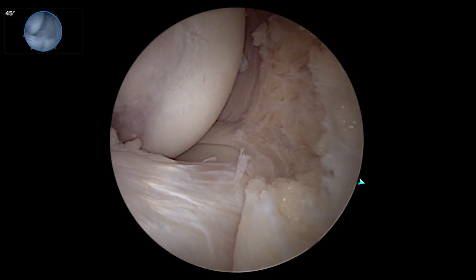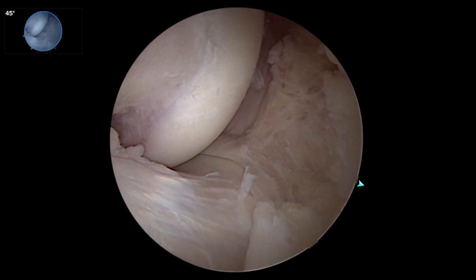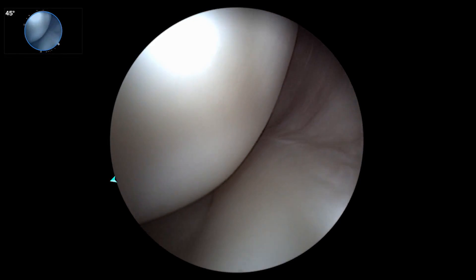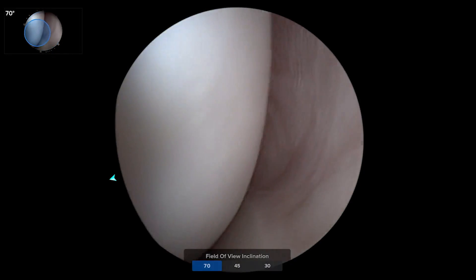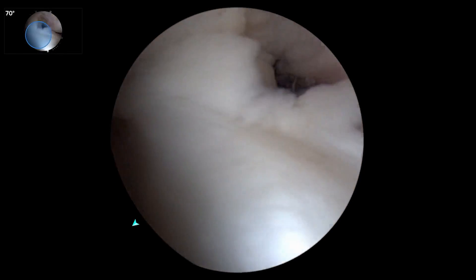Now, if you look up at the front, you not only see the ACL insertion and the whole anterior horn of the medial meniscus, but coming around to look up the gutter from here — which is always a very hard view — switch to the 70-degree view and it's easy from the medial side to see all the way up the medial gutter.